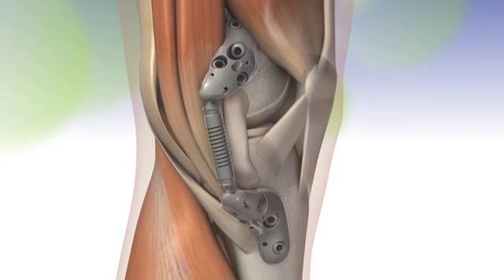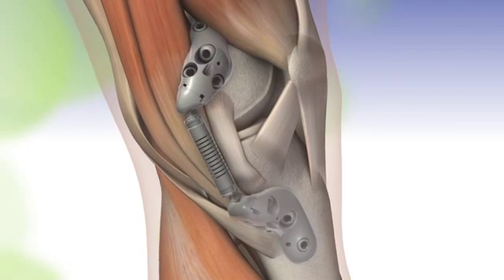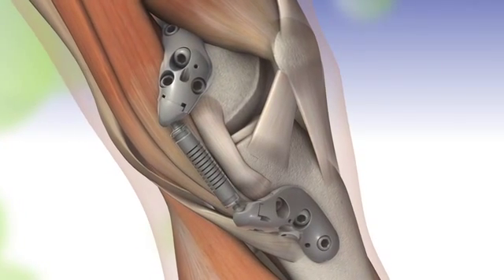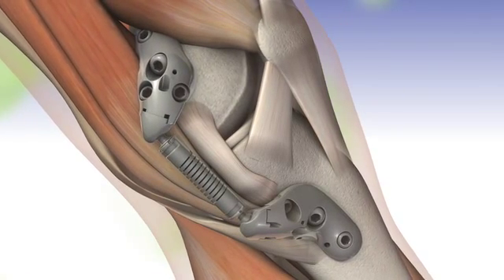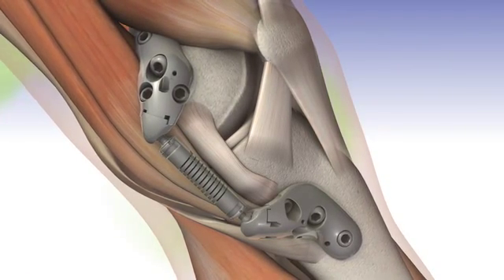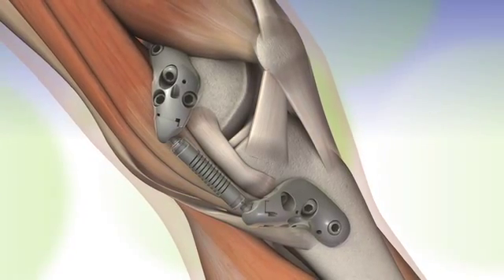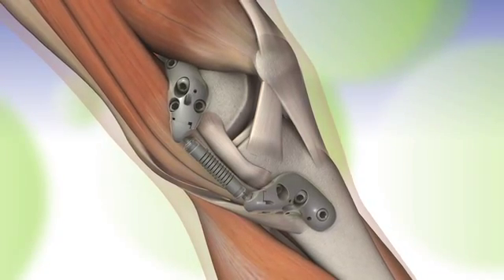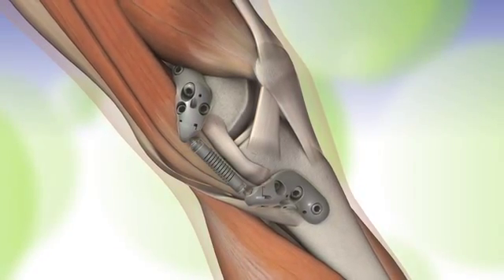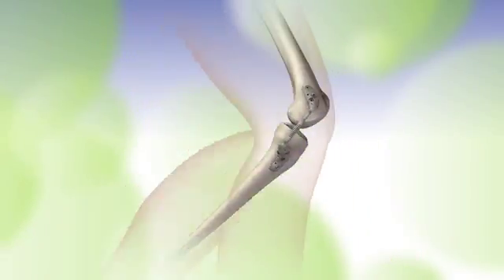The Kinespring system consists of an articulated absorber attached between femoral and tibial bases. The absorber includes a spring that absorbs painful knee loads with each weight-bearing step. The Kinespring system is designed to absorb and reduce load on the medial compartment of the diseased knee.